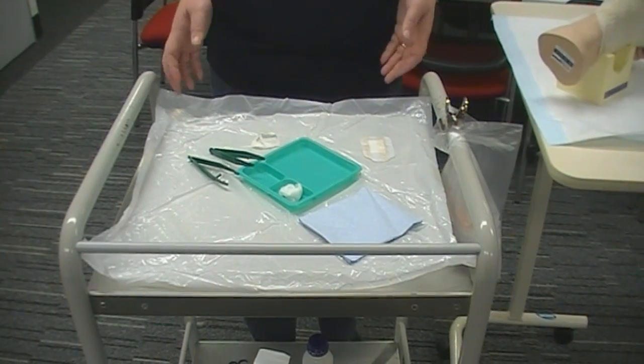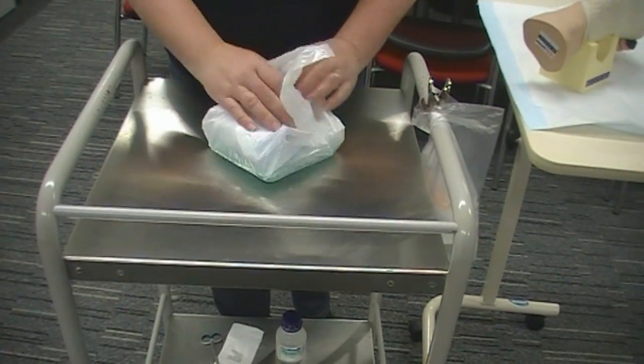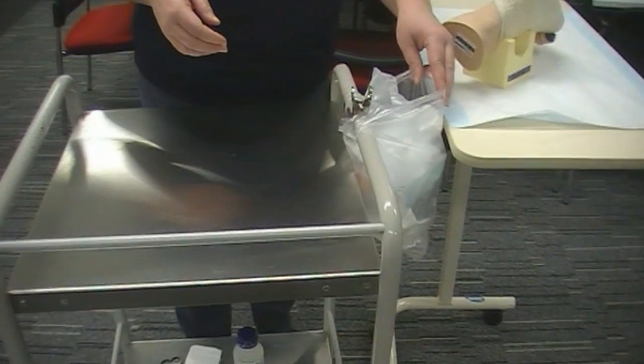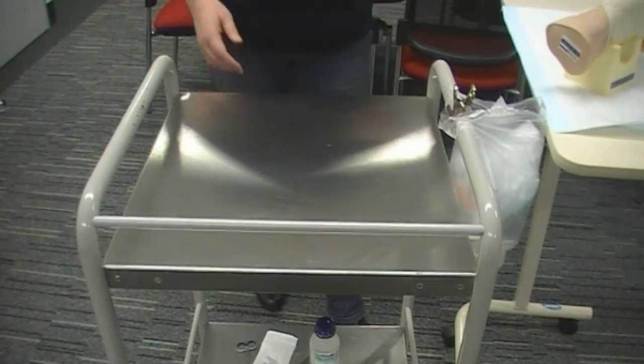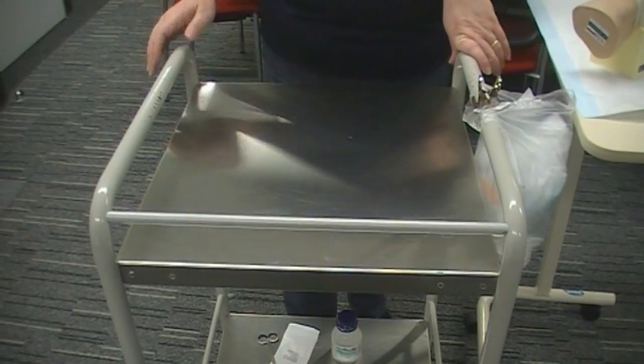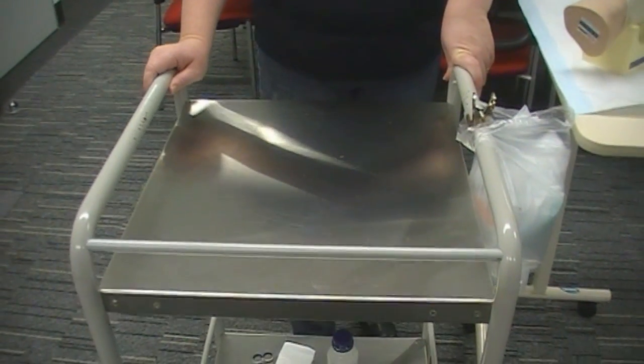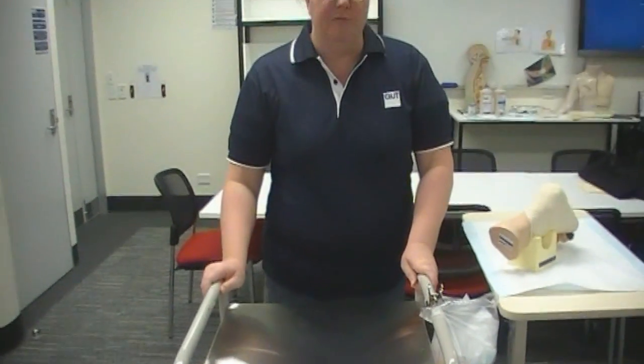Once we're all finished and our patient is comfortable, to clean up we just put everything together and into our bag. This will either go into the hazardous waste or into the normal bin depending on the hospital policy. Clean down your trolley and put back your normal saline and scissors either into the sharps bin or off to be recleaned and repackaged. Also wash your hands once you've finished all of this process. Make sure you've documented everything required within the care plan, the wound plan, or the progress notes depending on where that documentation needs to be for your patient. And look back on how you went and consider whether there are any changes or anything you might do differently next time.